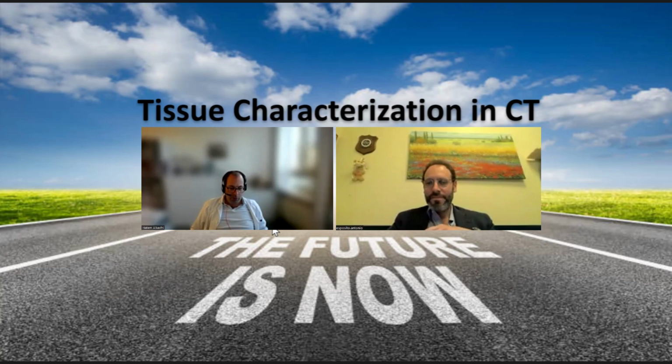Yeah, we have this issue in the emergency department where we have these patients, and they often get a CT for ruling out PE, a pulmonary embolism, and then 1 or 2 days later, the same patient should get a CT for ruling out CAD, because the troponin is a little bit higher. They don't believe in CAD, but they want to rule it out because they think it's a perimyocarditis. But since troponin is a little bit elevated and the pretest probability is not so high, they don't want to go for a cath, for catheter angiography.